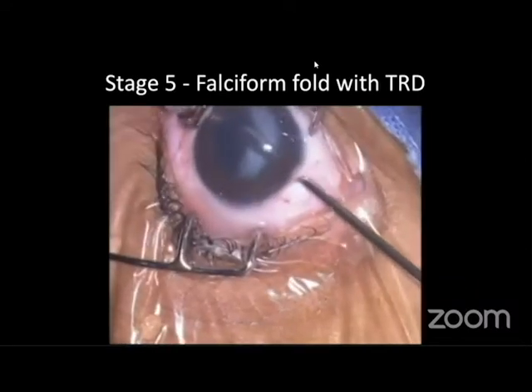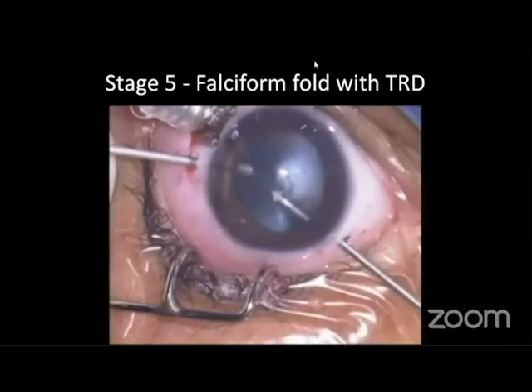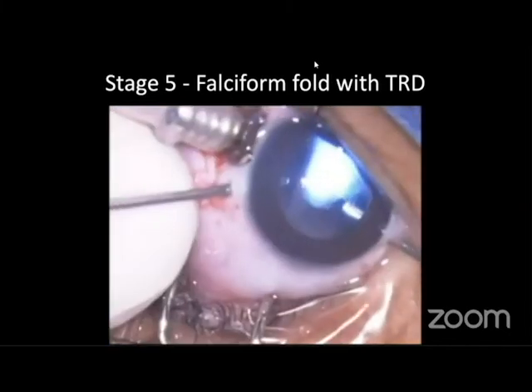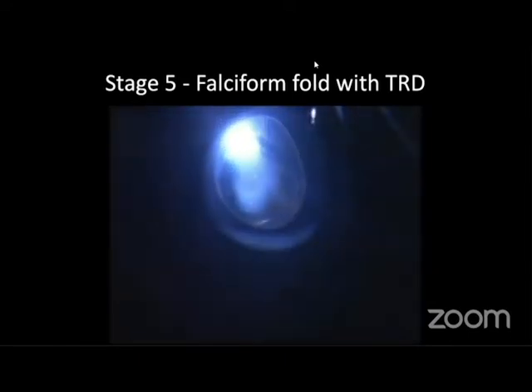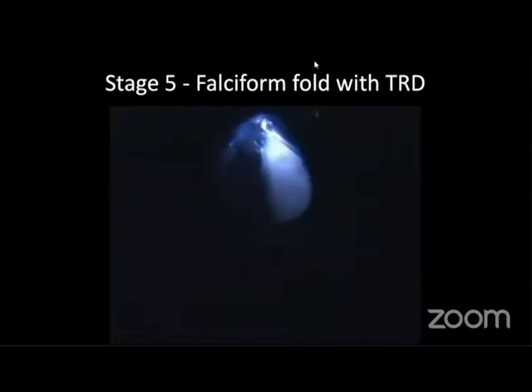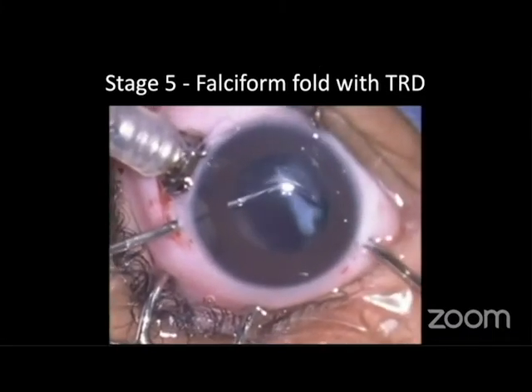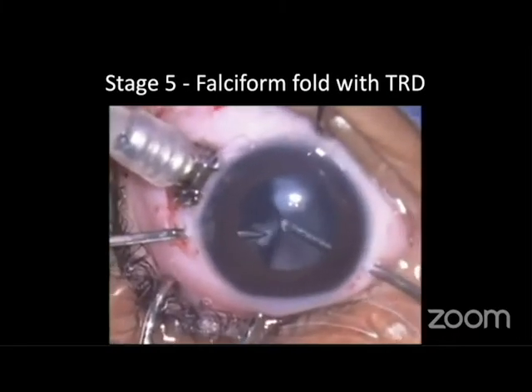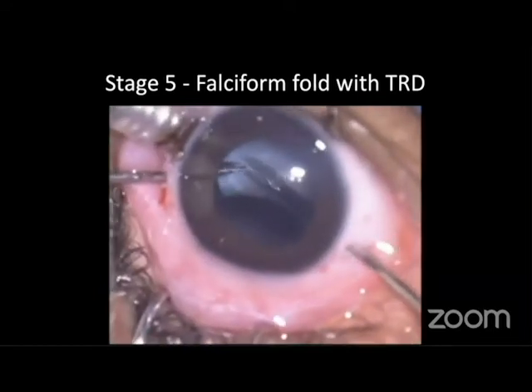Sometimes, in essentially zone 3 disease and zone 2 disease, we may find a falciform fold with traction retinal detachment. In one such patient the falciform fold is highly elevated, so we went ahead with the lensectomy, and one area of fibrous tissue growth from the falciform fold to the posterior capsule is there. This area of anteroposterior traction is relieved, and that fibrous tissue, which was attaching the retina to the lens, is dissected off, and the falciform fold is allowed to fall back over time.